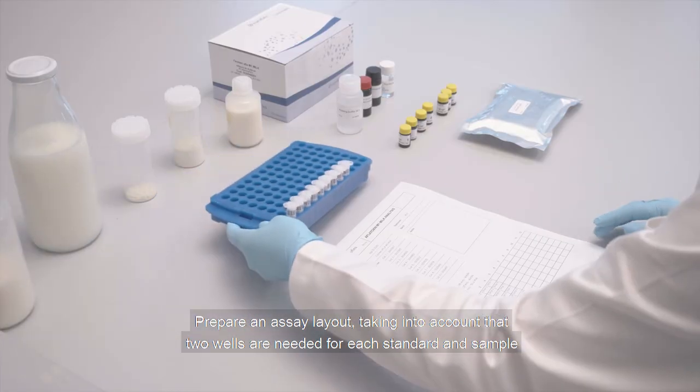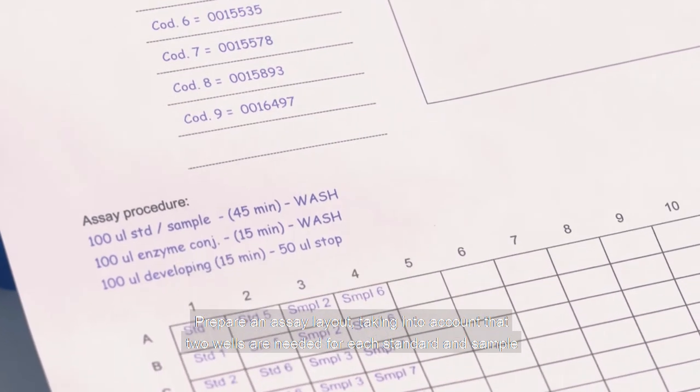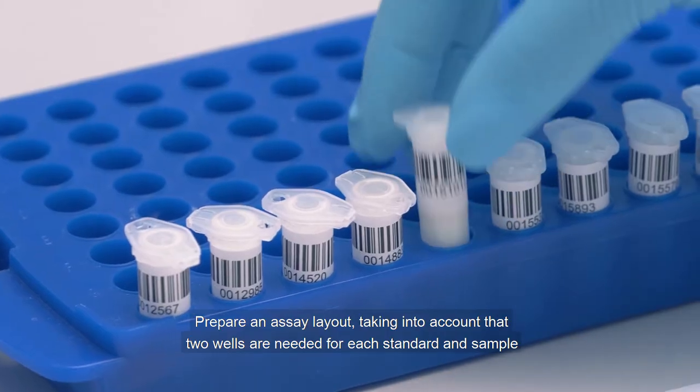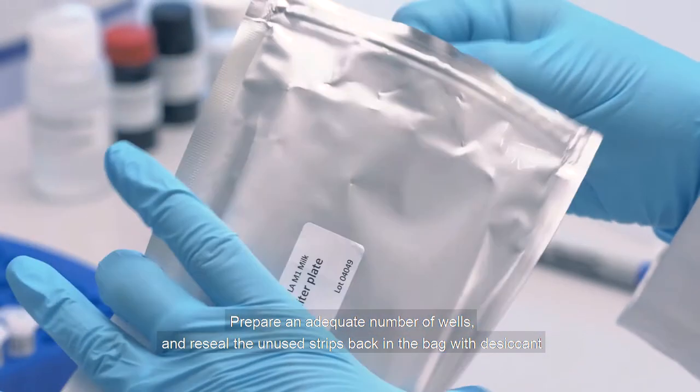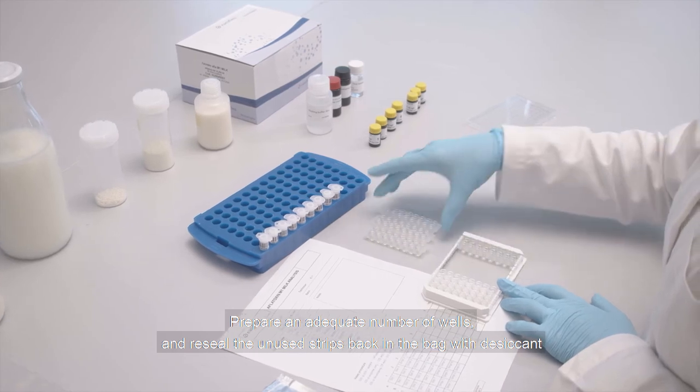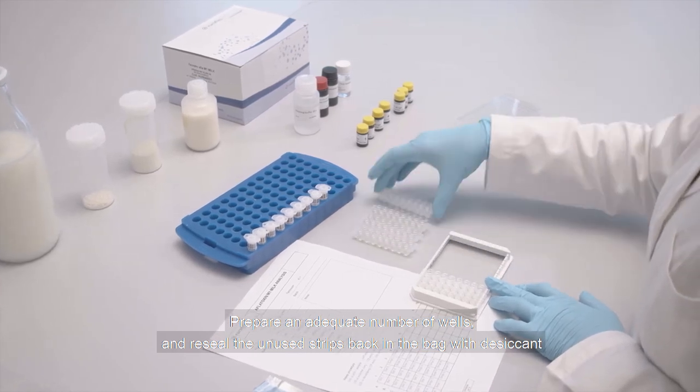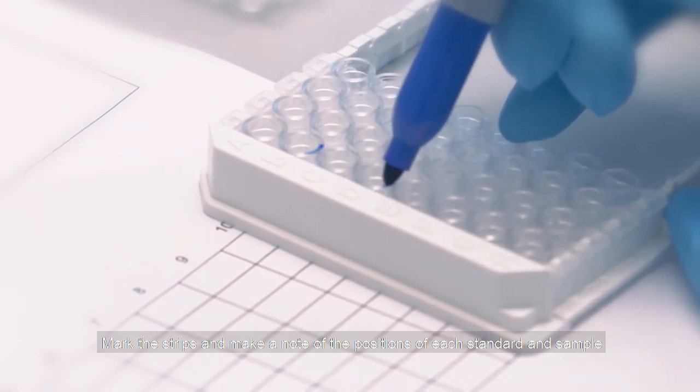Prepare an assay layout, taking into account that 2 wells are needed for each standard and sample. Prepare an adequate number of wells and reseal the unused strips back in the bag with desiccant. Mark the strips and make a note of the positions of each standard and sample.